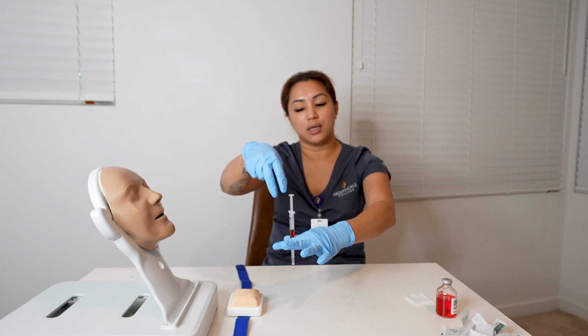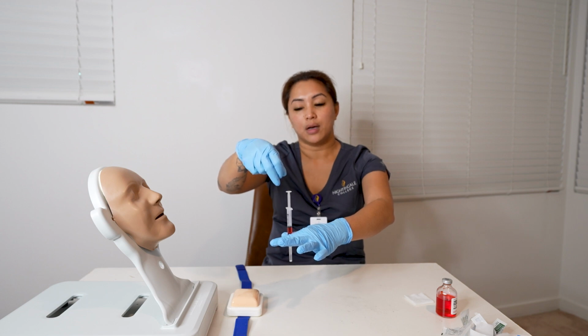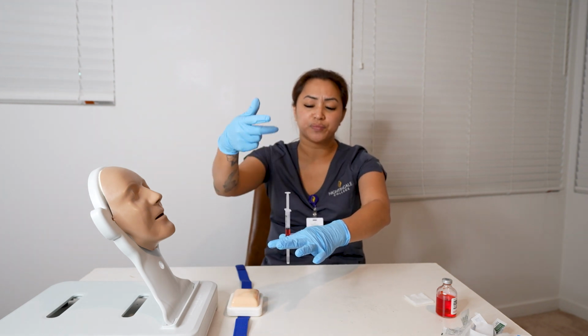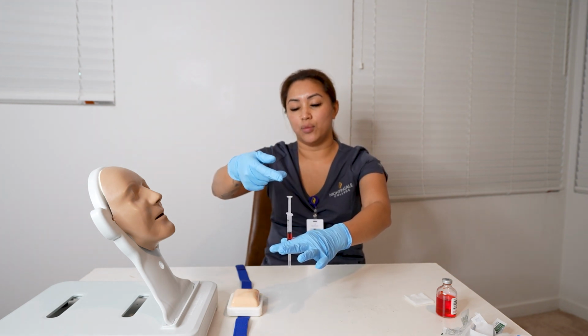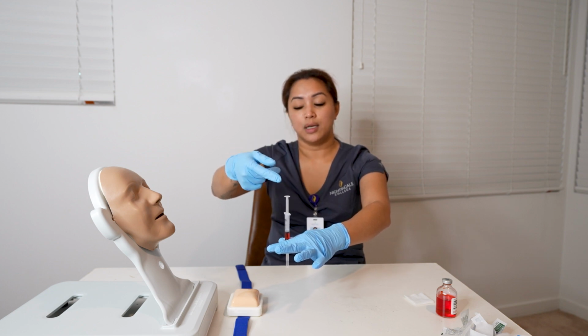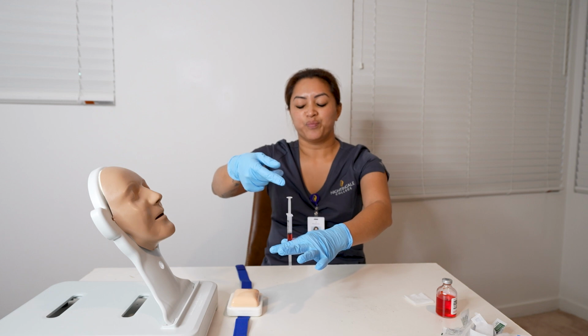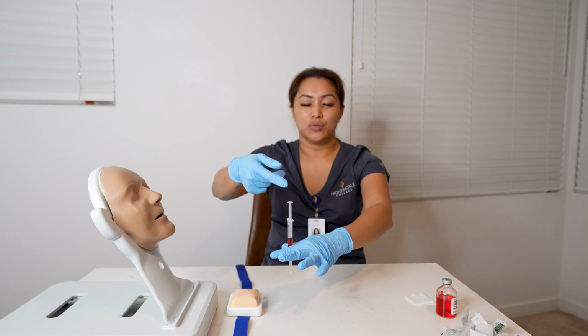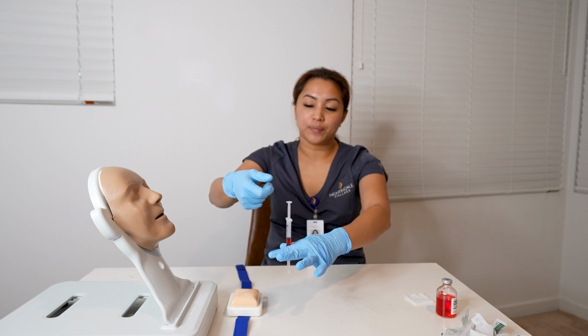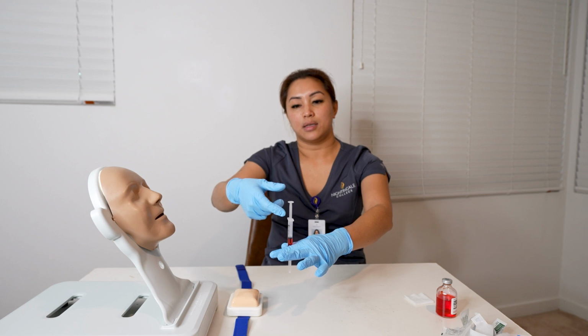How can we determine that? To see if there is any blood. If there's no blood that comes into the syringe, then we know we are in the deltoid muscle. So then while I am holding it, I am going to now inject the morphine sulfate into the deltoid muscle. We are going to be doing a 10-second per 1 milliliter, and then that's how we will do it.